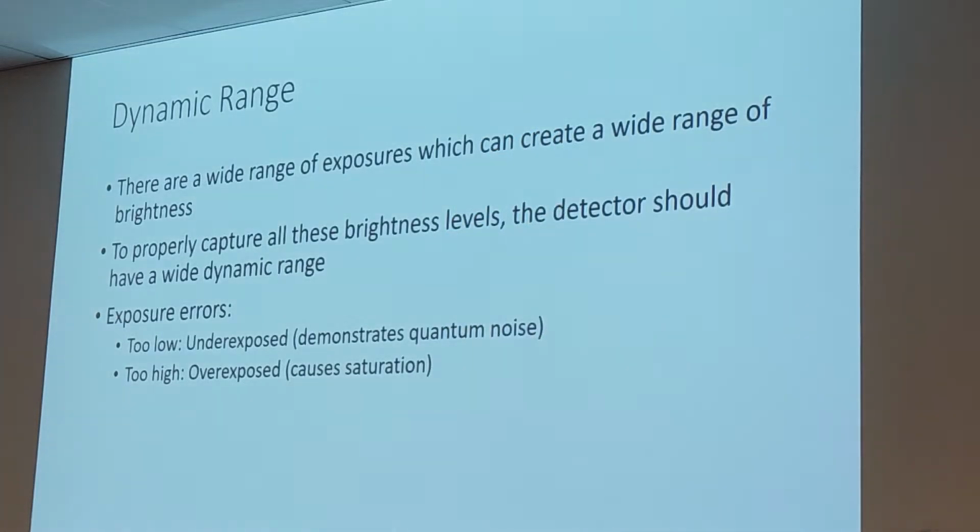So, on those Carestream machines, the portable knee, I believe the default setting is 60 kVp and 8 mAs max. That is with the assumption you are using a grid. Most techs do not use a grid for the knee when they do portables. If you leave it at that exposure setting, you will cause overexposure.